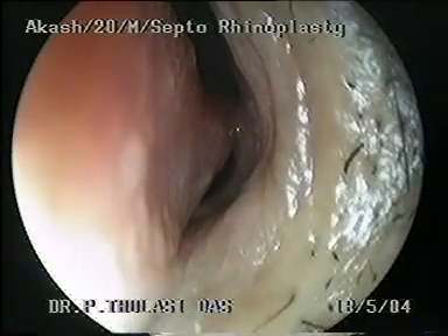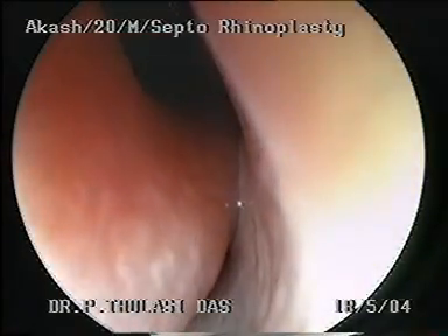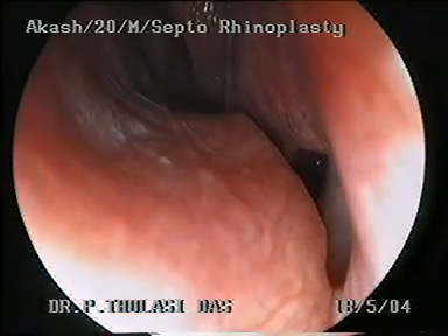This is Akash, a 22-year-old male with external deviation of the nose. The ala-columella complex is lying flat rather than standing up. Diagnostic nasal endoscopy showed gross anterior deviation of the septal cartilage to the left, with a septal spur in contact with the lateral wall, blocking the left nasal cavity.